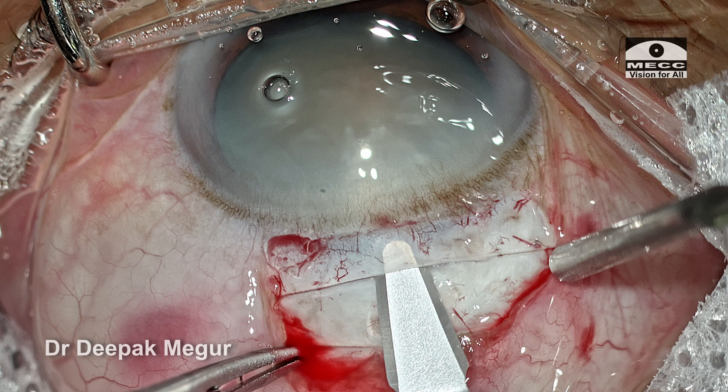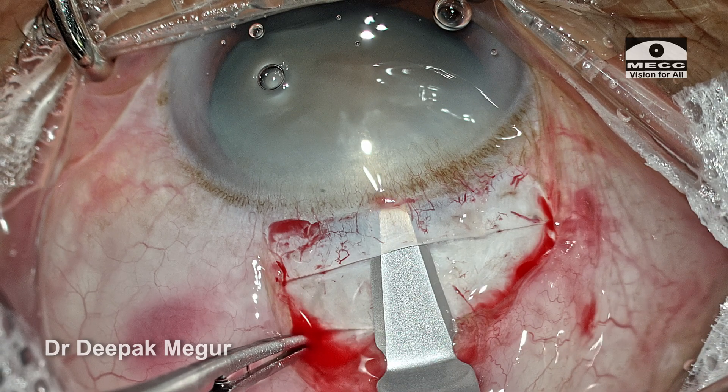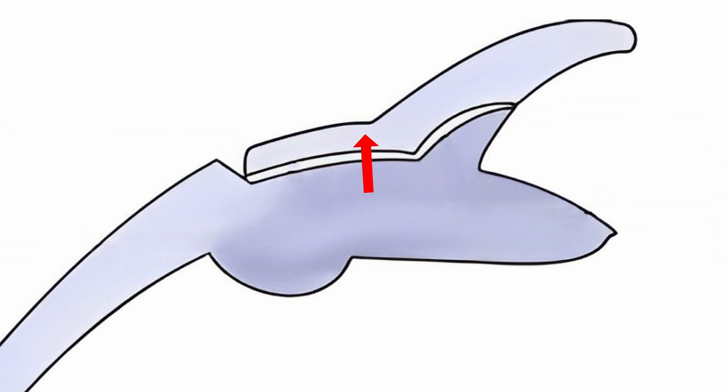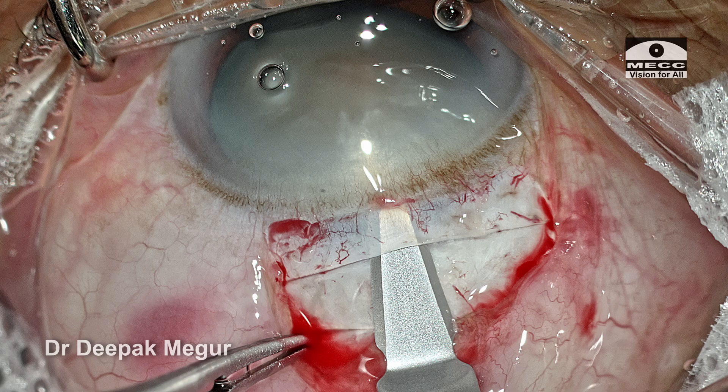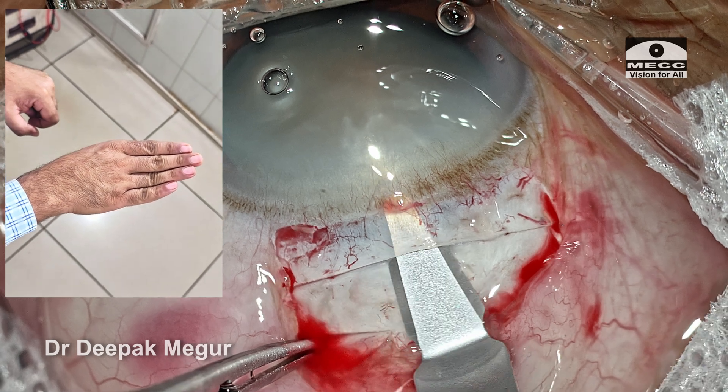As we reach the limbus through a wriggling movement, we need to stop for a moment because there is a change in the curvature of the globe as we encounter the cornea. The corneal curvature is slightly different from the scleral curvature, and that is the reason why we have to have a mild change in the direction of the blade — it has to be turned anteriorly just a bit to create the corneal part of the tunnel.